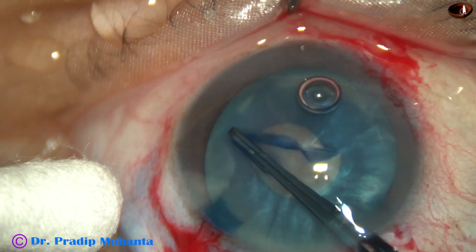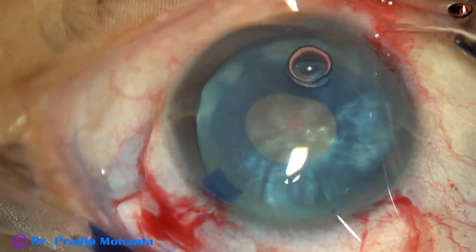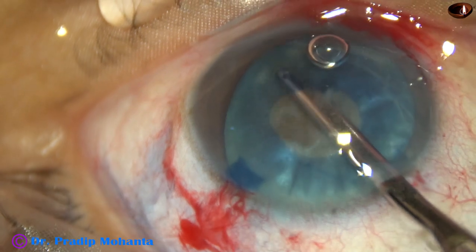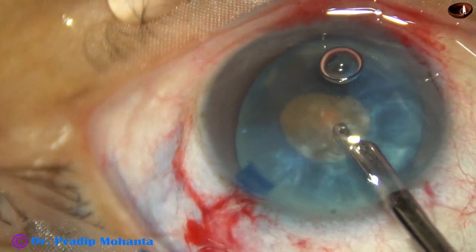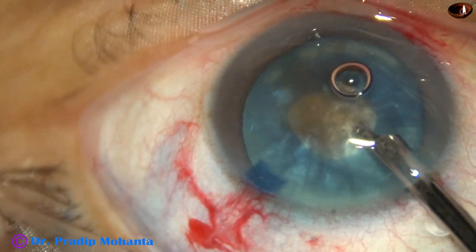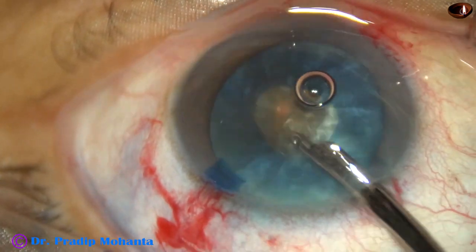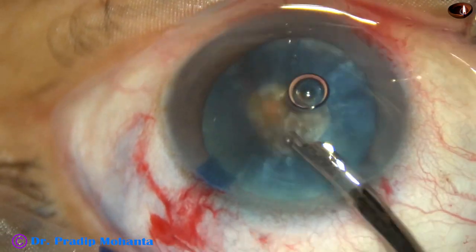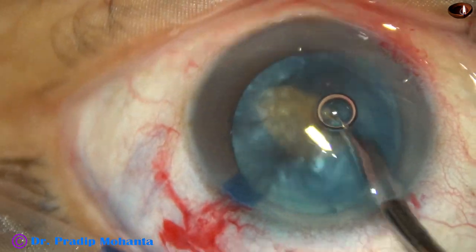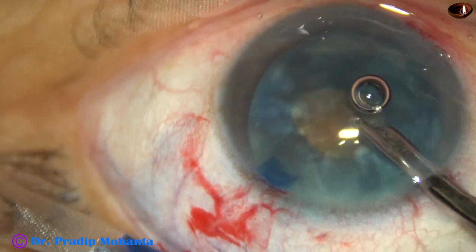A mini-rhexis is done. A 23-gauge Simcoe cannula is taken and aspiration of cortical lens matter is carried out. Considerable time is spent aspirating the cortical lens matter and trying to rotate the nucleus with the Simcoe itself. The nucleus rotates and large amounts of cortex from the periphery and from behind the nucleus come along the equator anteriorly — this is anticlockwise rotation — and big chunks of cortical lens matter come out.